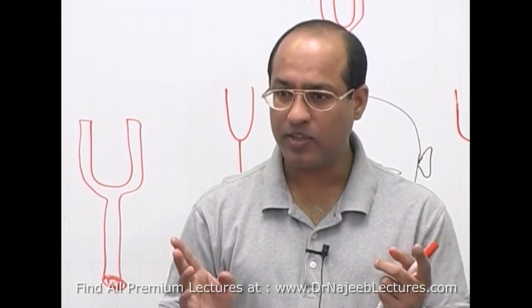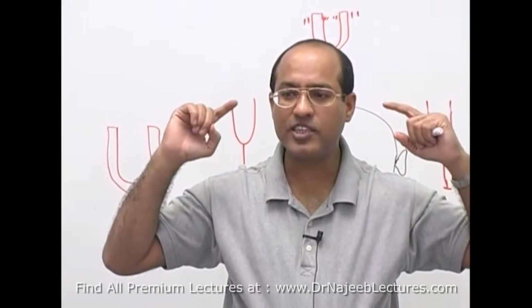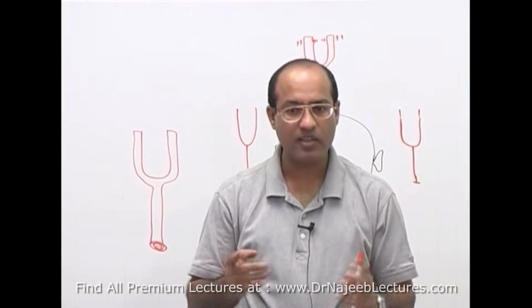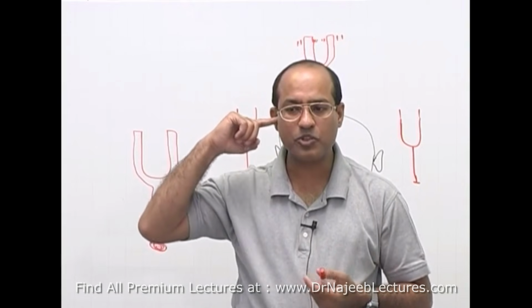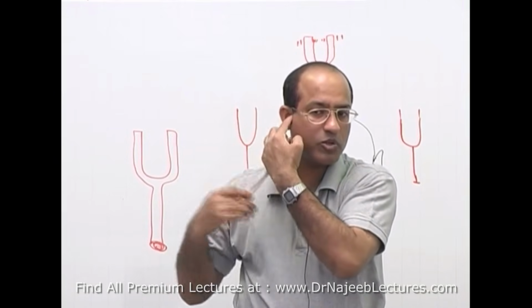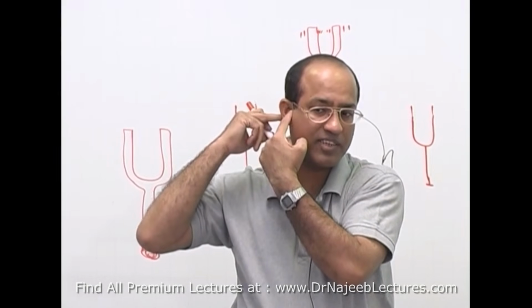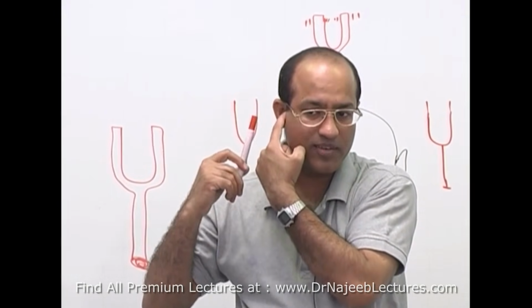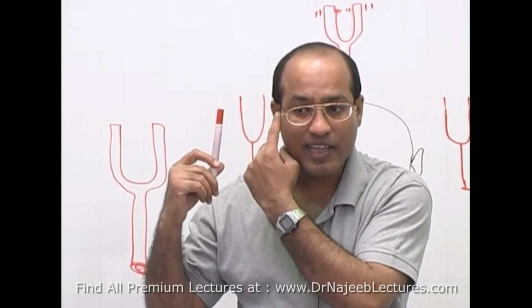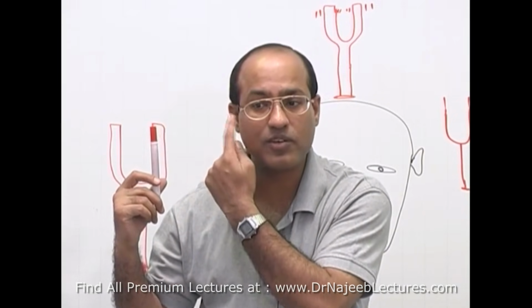Normally, you should have Weber not lateralizing to any side, and you should have Rinne's test in such a way that air conduction is longer than bone conduction. This is normal. Now if you have conductive deafness, let's suppose you block this ear. Number one, Weber will lateralize to this side, and number two, when you do Rinne's test, you will keep on hearing from the mastoid. As soon as you stop hearing from the mastoid, you bring it here. Will you hear? No. So what really happens here? Bone conduction was longer than air conduction. It means air conduction is not going through the conductive process, so there is conductive deafness in this area.